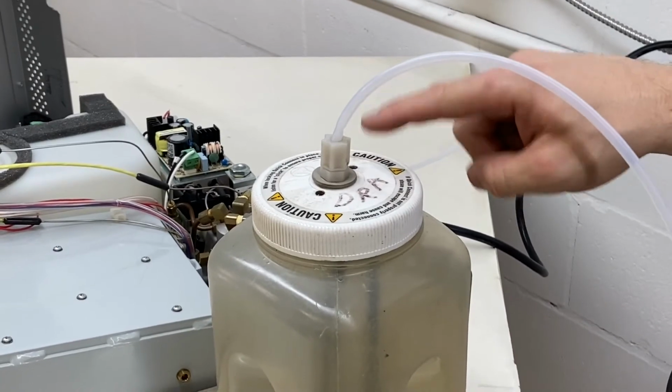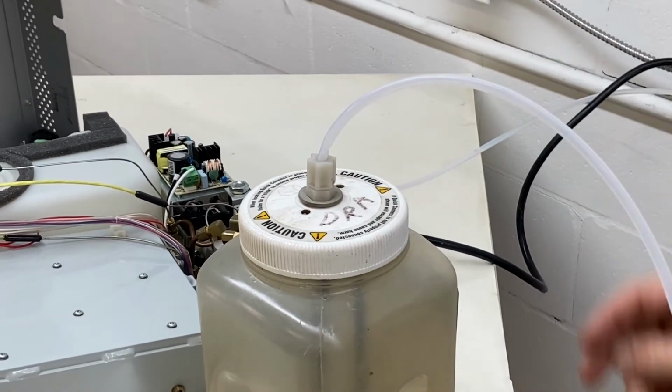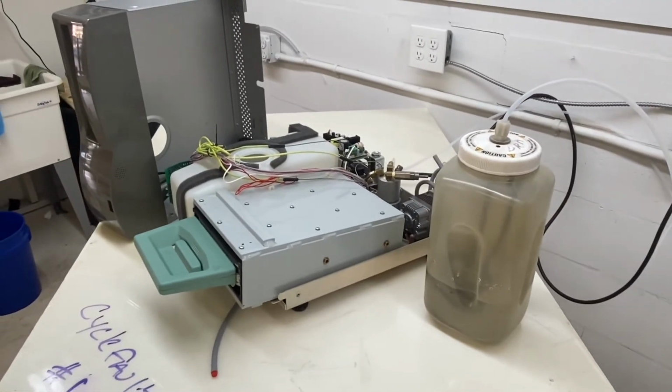Say you do got a kinked or pinched area here, just get a pair of pliers, cut this back, slide the nut back, give us a call, 704-966-1650, option 3. We could talk you through how to fix that. Let's do that. And anything else you need for that matter.